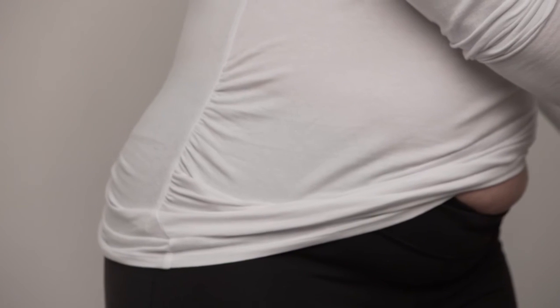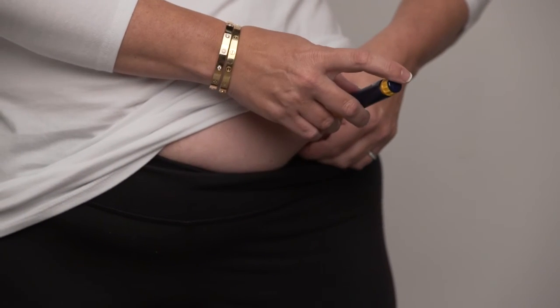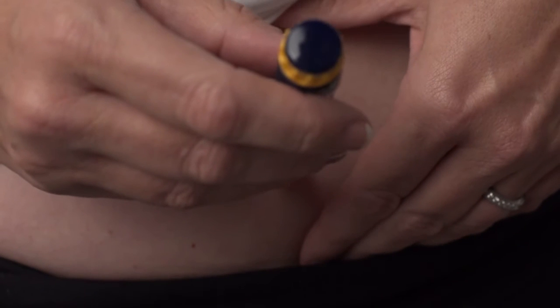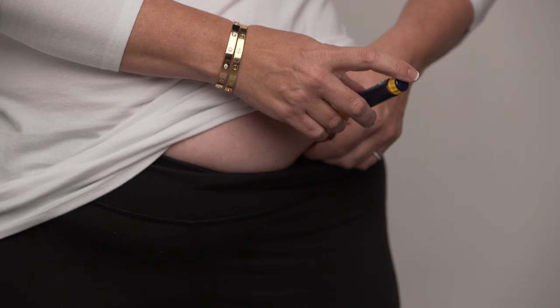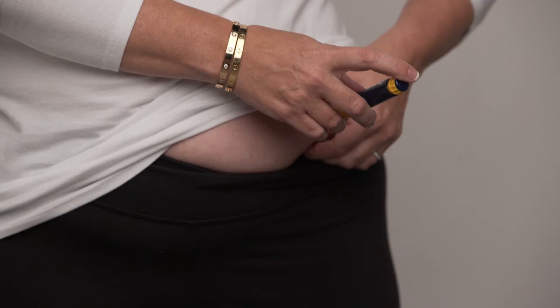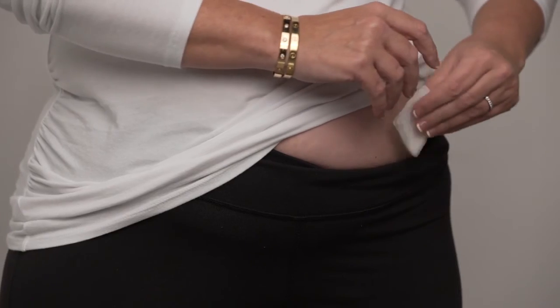Pinch the injection site between two fingers. With the other hand, insert the entire BD Microfine pen needle straight into the skin. Release the pinch, then press the injection button all the way in to be sure you have been given the full dose of the injection. Wait for five seconds before pulling the needle out of the skin. Pull out the BD Microfine pen needle and firmly press down on the injection site with a gauze pad. If necessary, apply a band-aid.